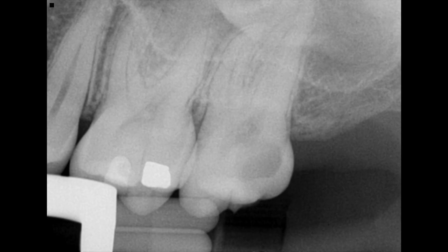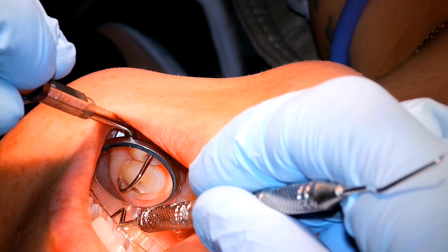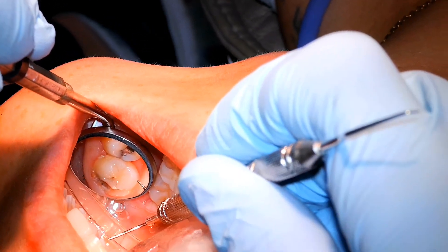This patient needed an upper left second molar removed. It's a restorable tooth, but the patient just didn't want to go ahead with that — having pain, wants it out. The big consideration here is the sinus. You'll see the floor of the sinus and how the roots are kind of up around there, so we do need to be a little cautious. I'm just testing the anesthesia, making sure everything is fine for the patient.